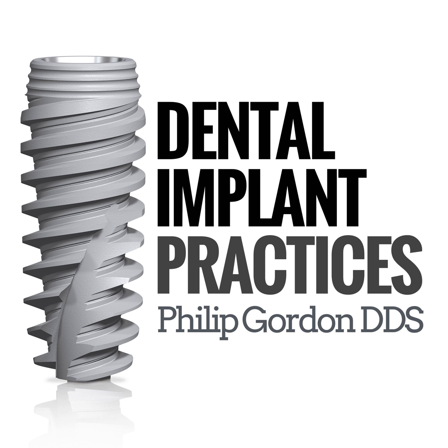Then the engineer at Glidewell, they're manufacturing the inclusive implants, so they have complete implant manufacturing. They took my drawings and refined them some more, and then made me some prototypes that we could put in. So one of the features is the change of the pitch of the threads, the 1 millimeter collar with built-in platform shifting.